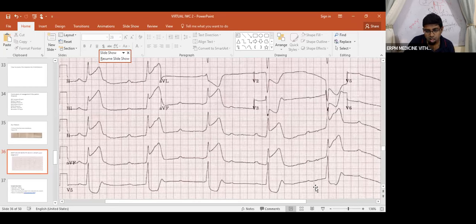What heart block is this? I'll come back to this. Look here. We study this in the ECG class. There's a full-blown ECG class in Viva part 2. Look here. This is an R wave, isn't it?